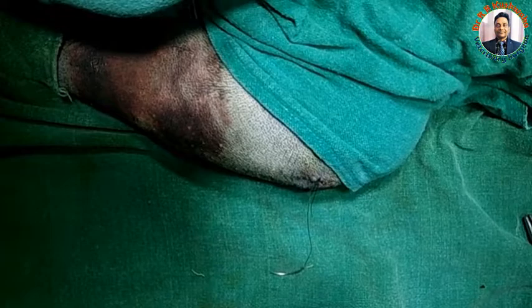That's it. This is closed reduction and antegrade intramedullary nailing of the left tibia.